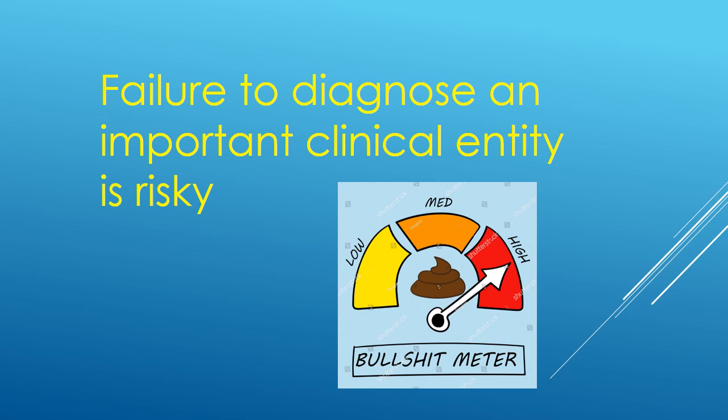And always there is a safer path available. So in case you strongly suspect a clinical entity and you get a normal result on the CT scan, then it doesn't mean that you end up giving contrast irrespective of the risk involved, because there is always another alternative existing.